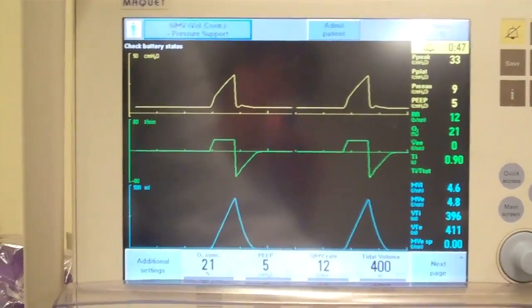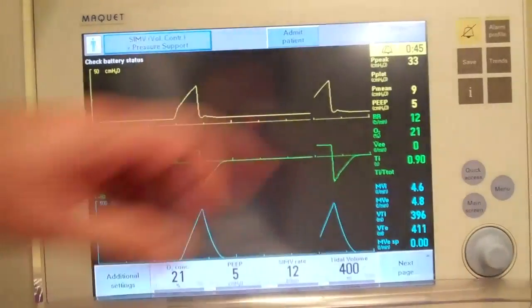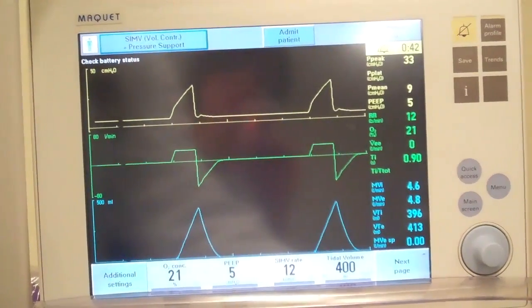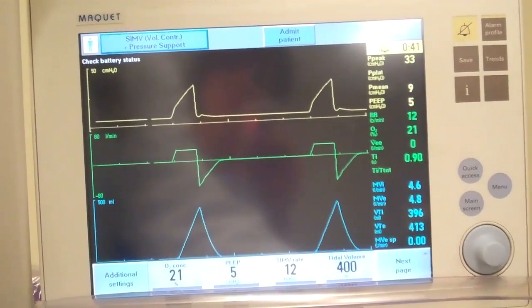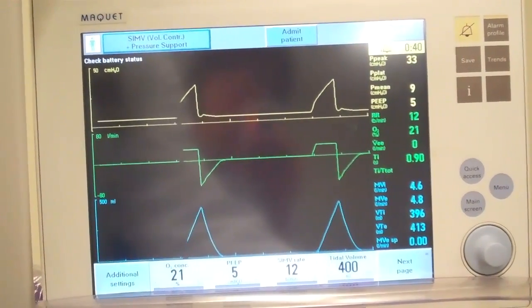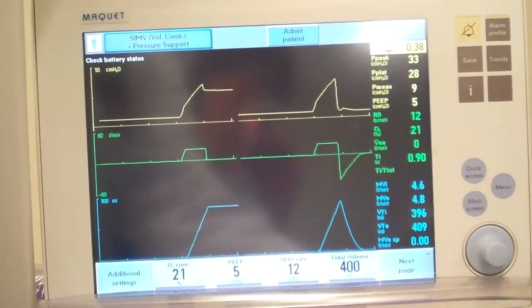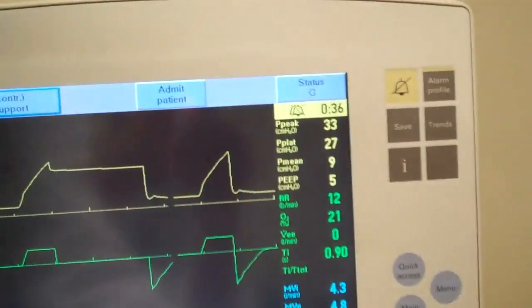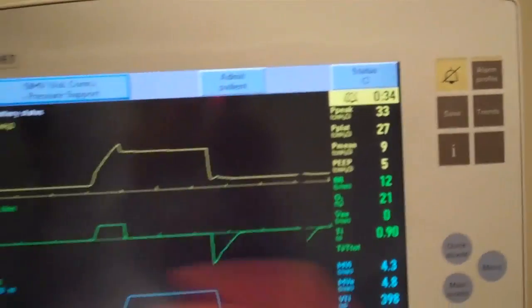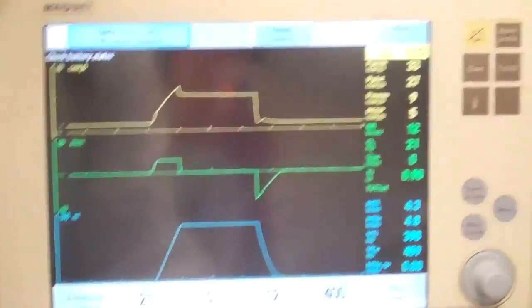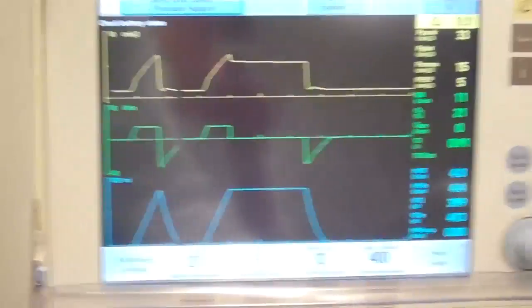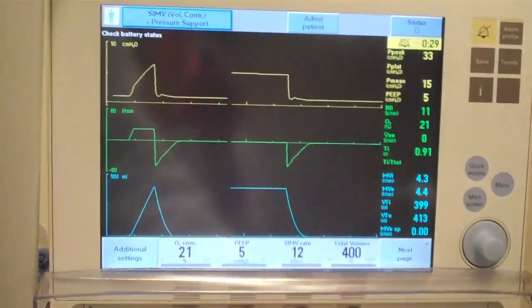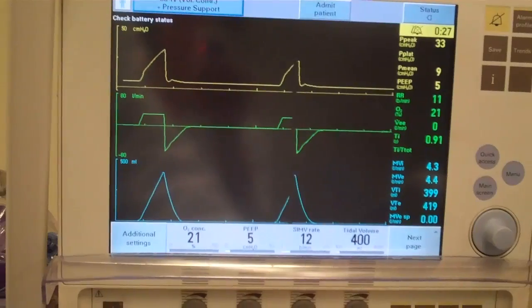We'll do that one more time just so you can kind of see. Right now you see there's no number in the plateau pressure section. We hit the pause, now the number comes up — you're just going to hold it for not more than one to two seconds, because you're holding that breath into the patient and that could cause some potential problems.